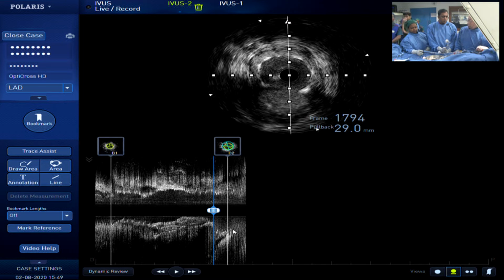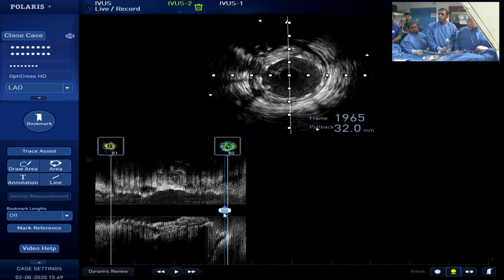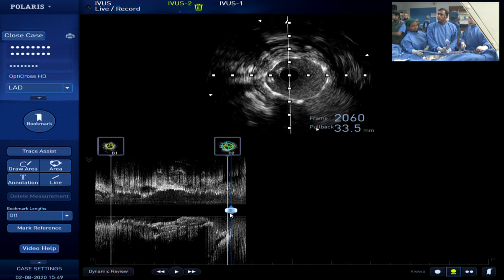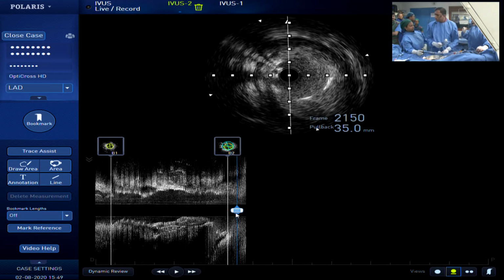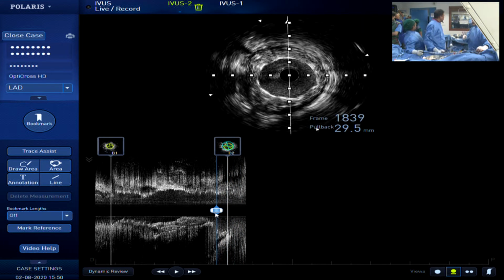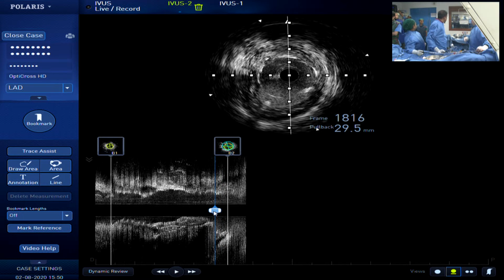Philips has stent boost. In that you can see the exact wire crossing. Okay. The size, we can do stent boost here. Yeah, it will be. This is a G machine. Okay. Then is it possible? Just a moment. It is in the Philips.